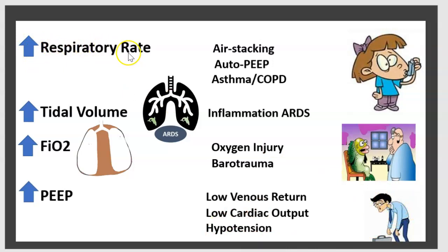Increasing the respiratory rate, look for asthma. Increasing the tidal volume, risk for ARDS. Increasing FiO2, risk for barotrauma and oxygen injury, and increasing PEEP, risk for hypotension.